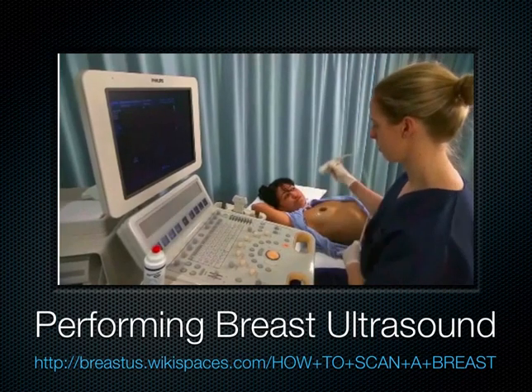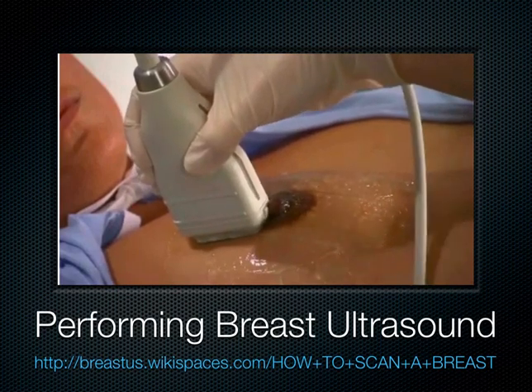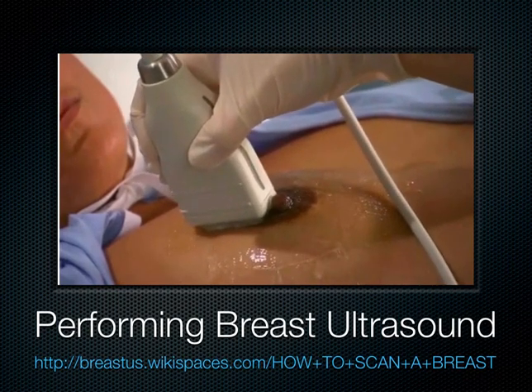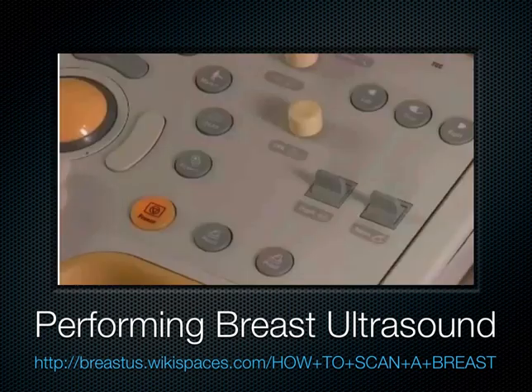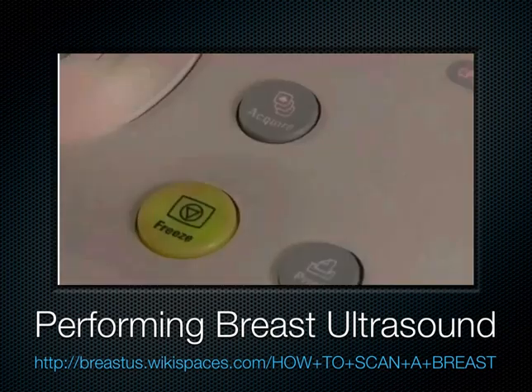To scan the breast with the clock method, place the transducer in the radial plane at the 12 o'clock position. Ensure that the notch of the transducer is facing the nipple. Manipulate the transducer until a suitable image of the breast is obtained. Freeze the image and then annotate the breast side, clock position, scan plane, zone, and structures. Save the image.